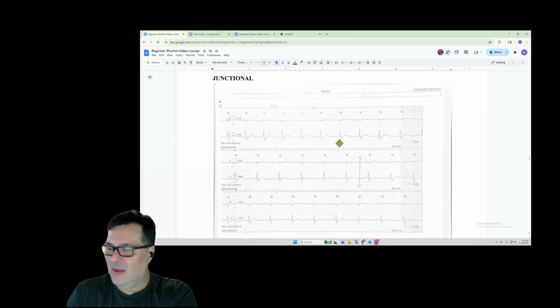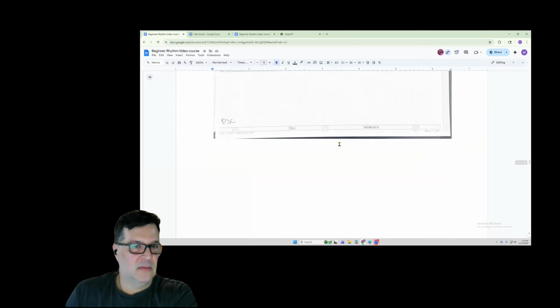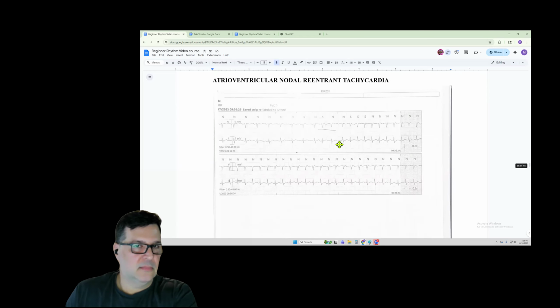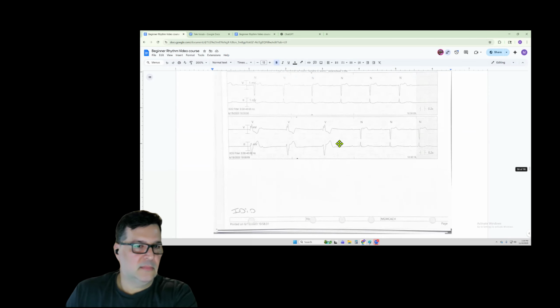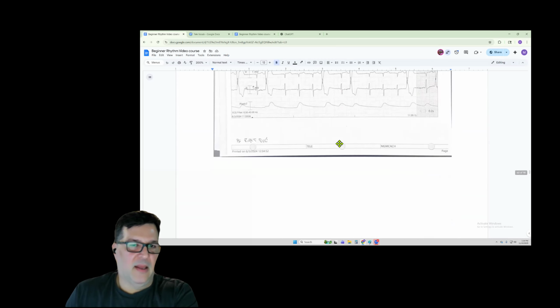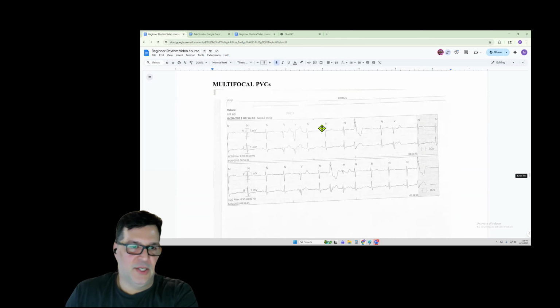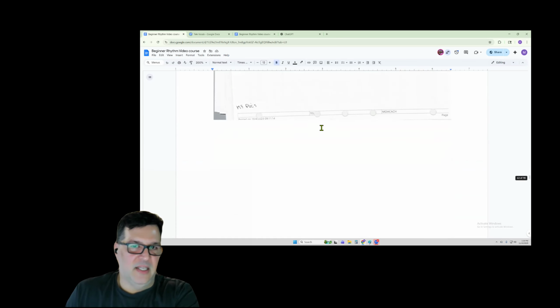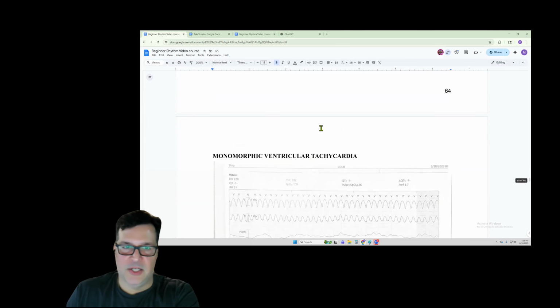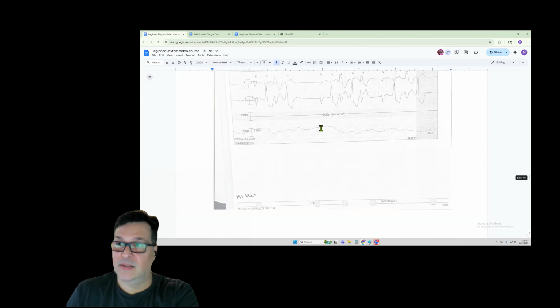Junctional skips there. Let's go to ventricle stuff. Talking to Emily last night, and I pitched this as beginner stuff, but a lot of this needs to be part 2. I'm trying to just go over the true basics.